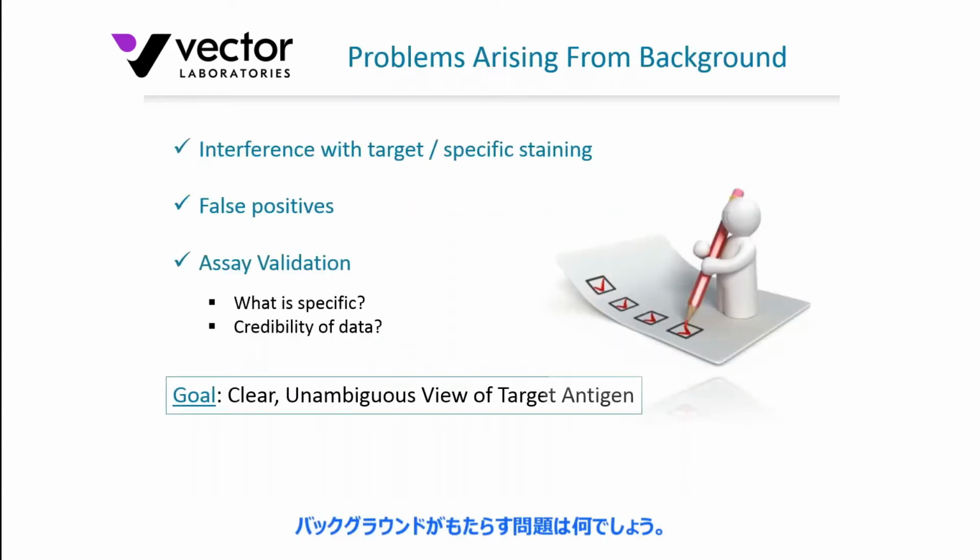So what are some of the problems arising from background in these applications? Certainly interference with the target or the specific staining you're trying to identify. There could be a lot of confusion with the antigen expression. This leads to false positives. Certainly there may be cells identified that are not specifically supposed to be positive, different cells, different cell types, indeed different cell compartments may stain. Potentially if you're looking for a nuclear antigen, there may also be staining in the cytosolic area.